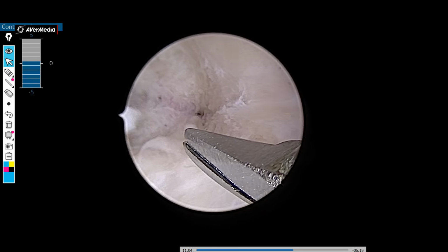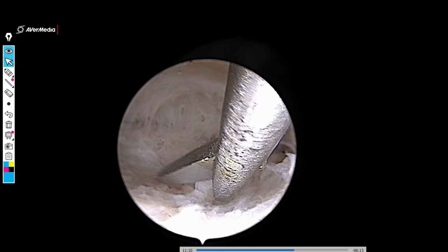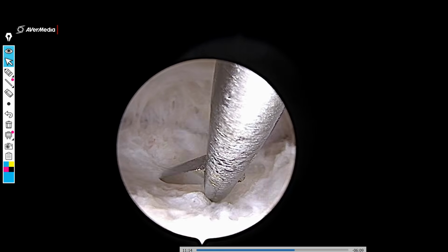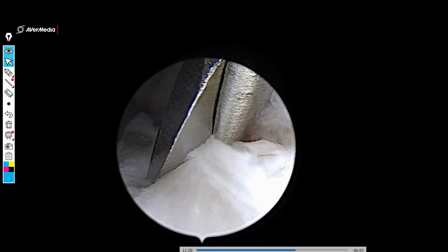It is more difficult and more tedious as compared to the standard incision, but in my limited experience, it has proven very useful, and patients have got pregnant quite well after this particular surgery. Okay, so this is now like the organic correction of the cavity.